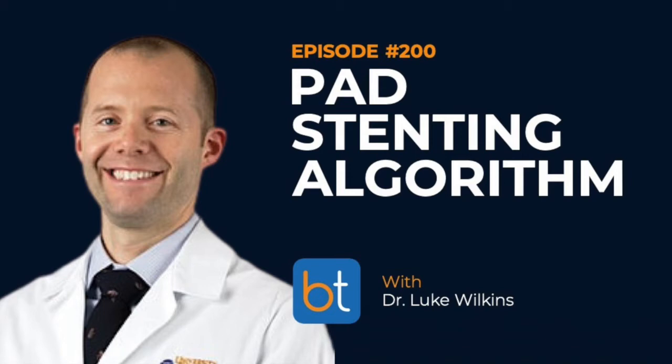I see. Would you care to expound on which atherectomy devices are your favorite, or maybe save that for a little later? Since we're on the top half of the flow chart, I think it's reasonable to talk about it, because the next step is if you are less than 10 centimeters, and that's when I'll do atherectomy and PTA. And the most frequent atherectomy device that I use is directional atherectomy, which is the HawkOne device.